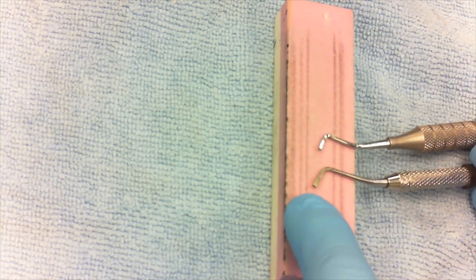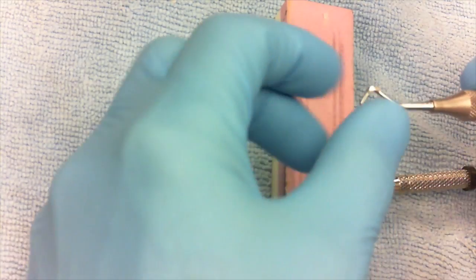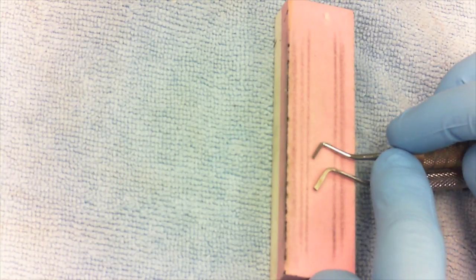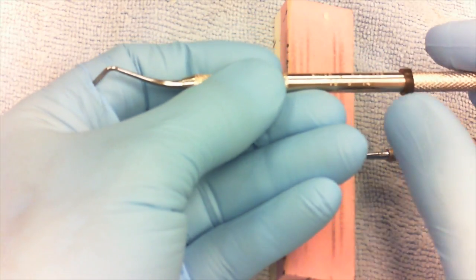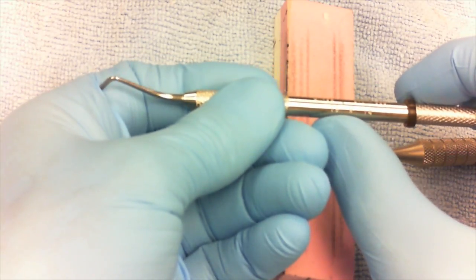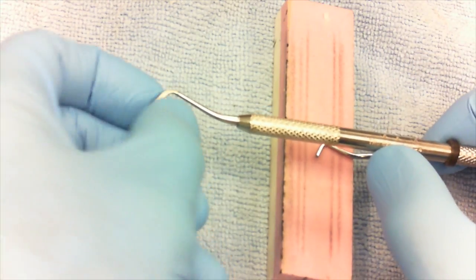So this instrument here is 15, which means 1.5 millimeters, and this instrument over here is 10, which means 1.0 millimeters. Take a moment to find the measurement on the instrument itself by holding it up and seeing there is in fact a 15 here as the first number on the instrument. That goes for all hand instruments.